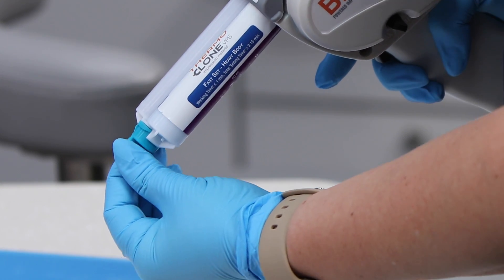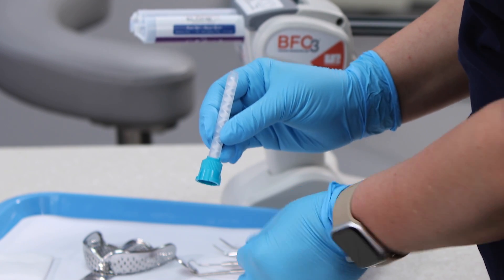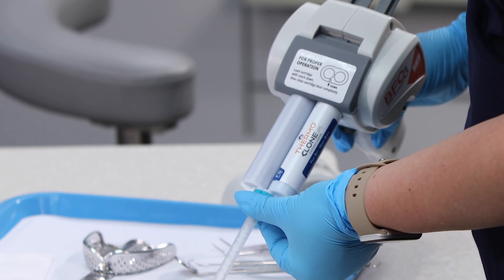Attach a new, unused mixing tip to the material cartridge. Be sure the hub color of the mixing tip matches the cartridge cap color. Using the wrong size mixing tip can prevent proper operation and damage the unit.